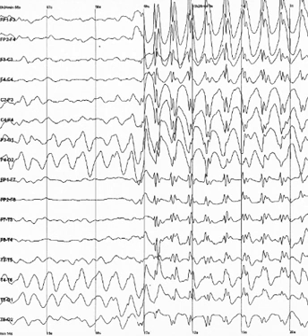However, the errors are very different between the techniques, and combining them thus allows for correction of some of this noise. MEG has access to virtually no sources of brain activity below a few centimeters under the cortex. EEG, on the other hand, can receive signals from greater depth, albeit with a high degree of noise. Combining the two makes it easier to determine what in the EEG signal comes from the surface, since MEG is very accurate in examining signals from the surface of the brain, and what comes from deeper in the brain, thus allowing for analysis of deeper brain signals than either EEG or MEG on its own.